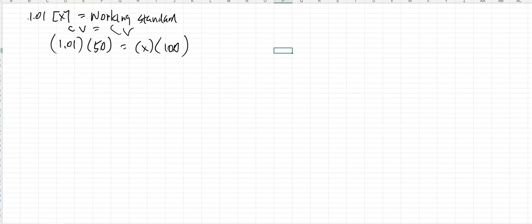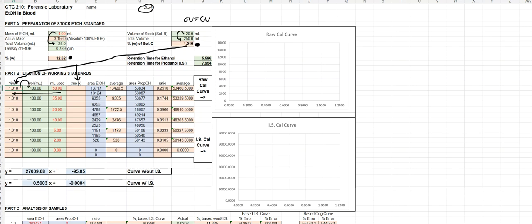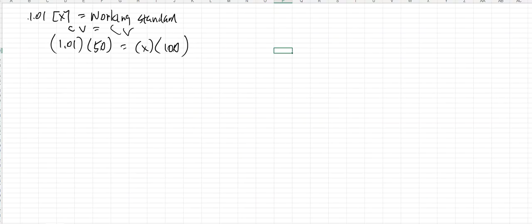So this is just a dilution problem. All of these will be dilution problems, again very similar to the one before. This is my initial concentration, though, for all of them. That's why they're all the way down. These are the volumes that we used to make those standards with: 50, 35, 20, 10, 5, and 2. And we took that to volume in a 100 ml volumetric flask based on this standard prep. Was ours the same? Again, go back and watch. It will tell you. So we need to calculate the true concentration of these standards that were prepared. And that's how we do it.